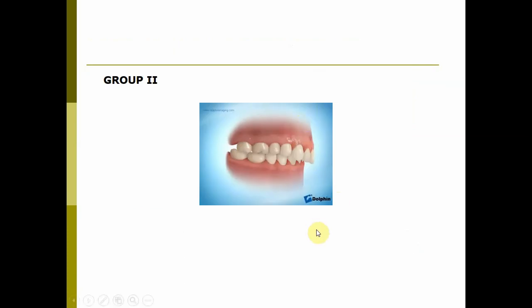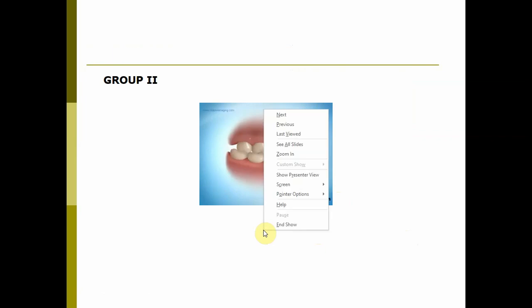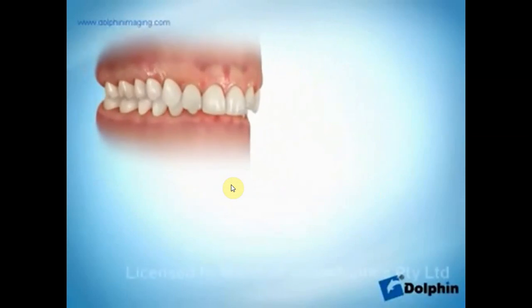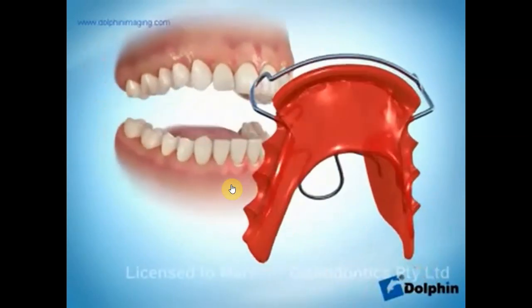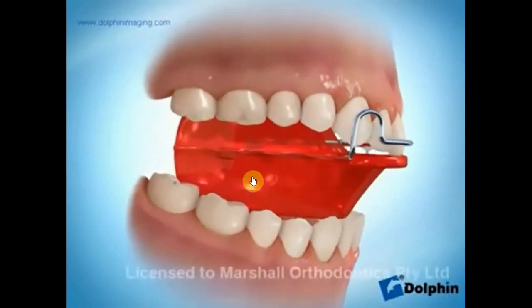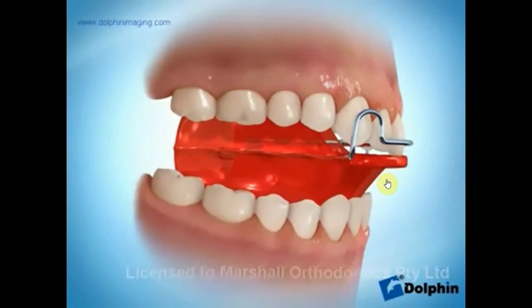Your group 2 appliances will be those which will help to redirect your jaw growth. That means redirect your growth of the mandible in this case. So this is also a type of myofunctional appliance. If you see carefully, in a class 2 patient, I'm giving it, and I am gliding the patient and forcing the patient to bite forward in a class 1 molar relationship.